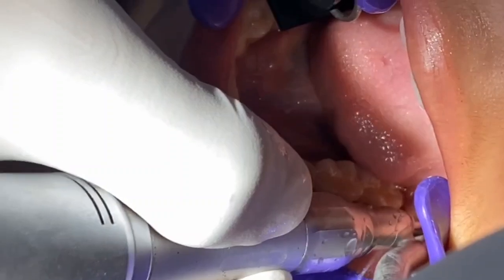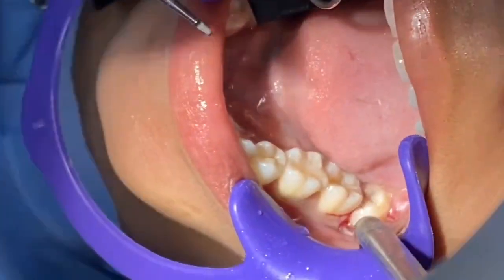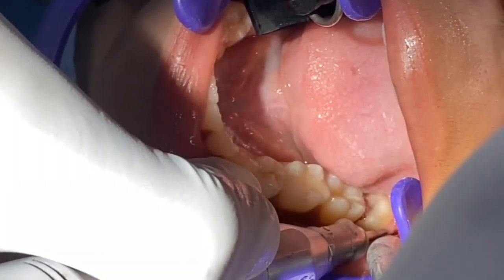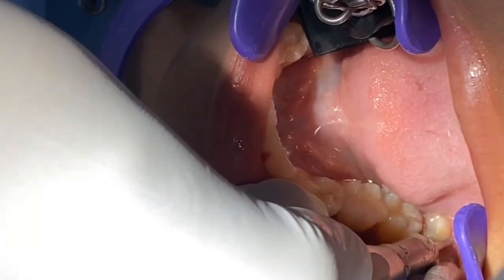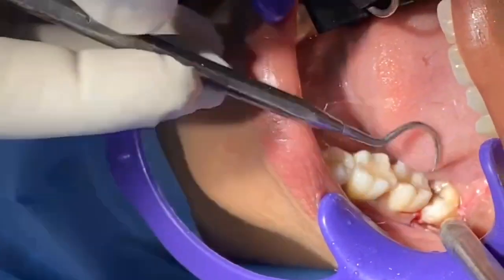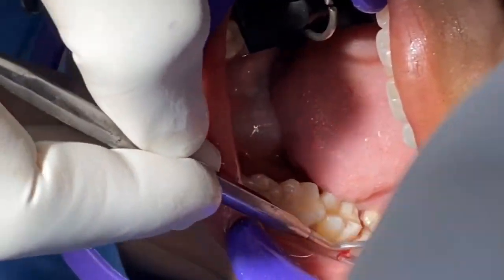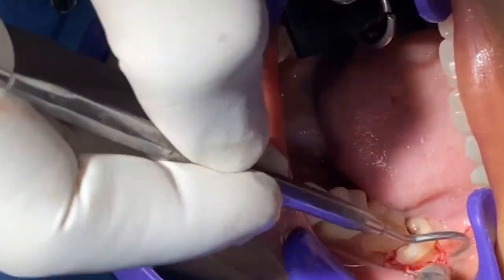We need to always orient to see the plane of this tooth. I am getting into the outer cortex, I am getting into the inner cortex. So this is the tooth. The root you can see. This is the outer cortex, which is being identified. This is the inner cortex. This is the tooth.